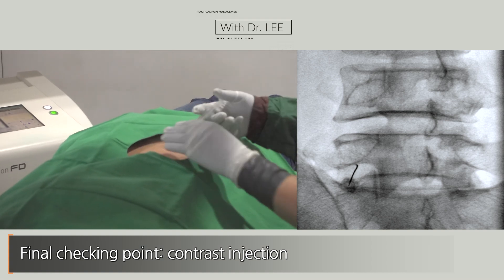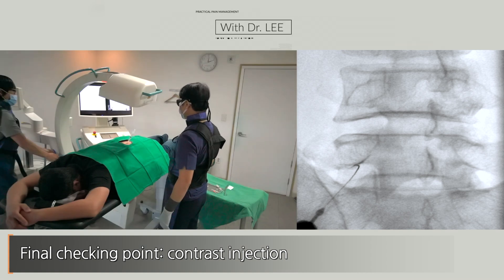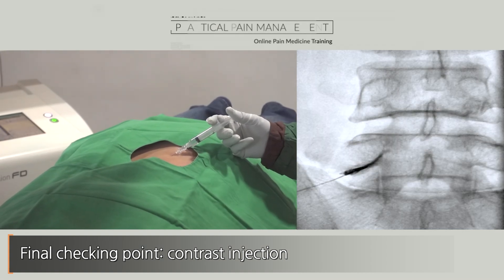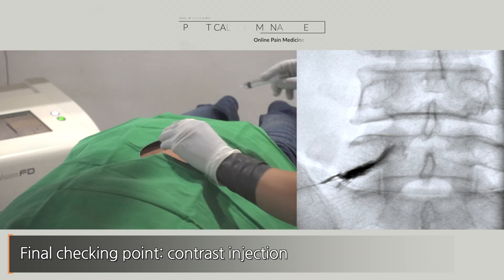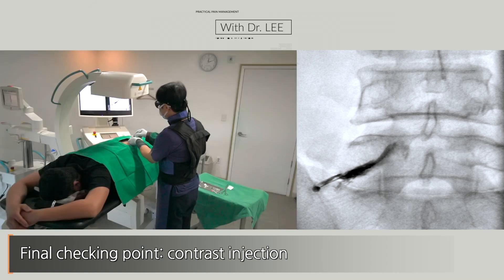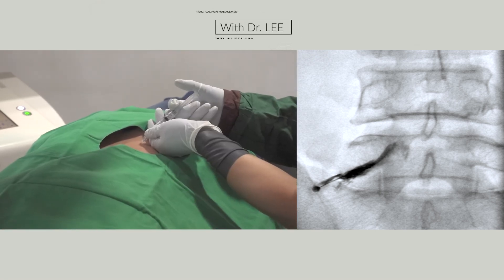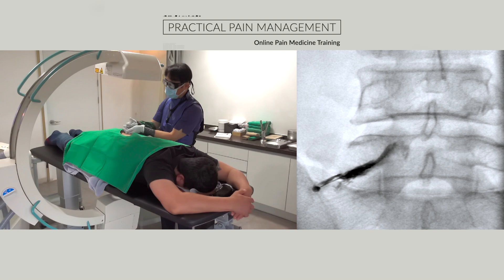If I am sure my needle has reached the ideal target, I connect the contrast-filled syringe with the spinal needle. While assembling syringes or during the injecting process, I must stabilize the spinal needle. Contrast media injection is the final touch before steroid injection. I have to stabilize the spinal needle while I disconnect the syringe. And finally, steroid injection. I have used an injectant mixture of local anesthetics, high concentration of dextrose solution, and triamcinolone.